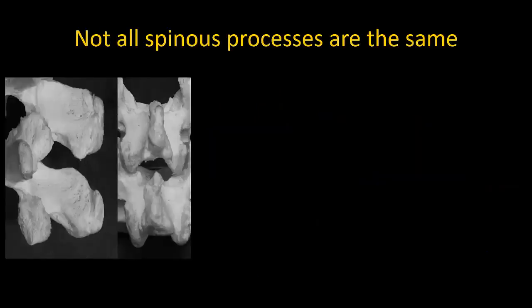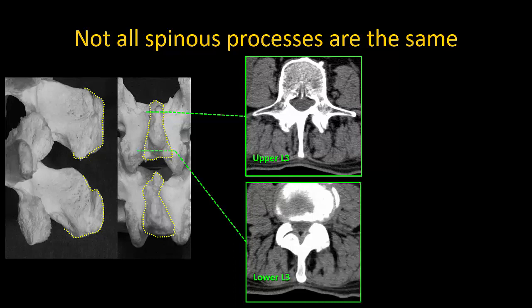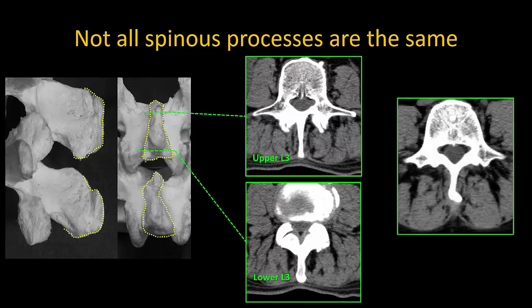And of course, in real patients, the shape of spinous processes are not regular. You can see, though, that the pyramidal change in width of the spinous process still generally holds true. Note that age-related changes often result in the spinous processes and their tips becoming distorted and widened. I have found this to be particularly true in older people who have done a lot of heavy lifting over the years. This affects how lateral you have to insert your needle to bypass the tip of the spinous process, and consequently the lateral to medial angle will also vary.